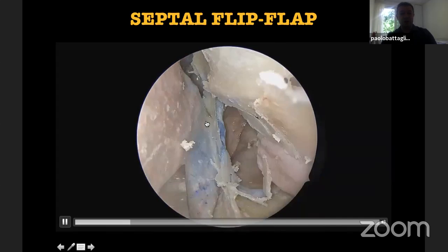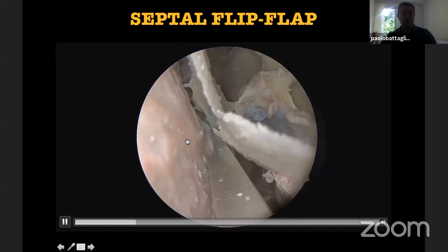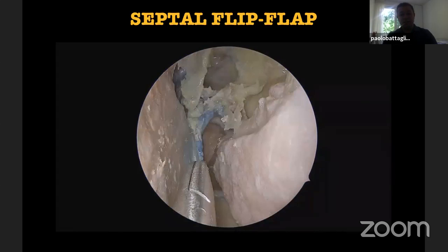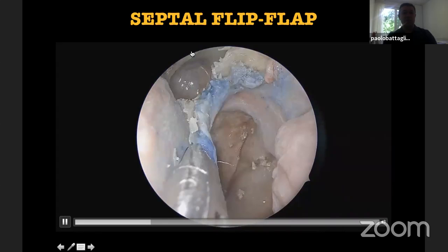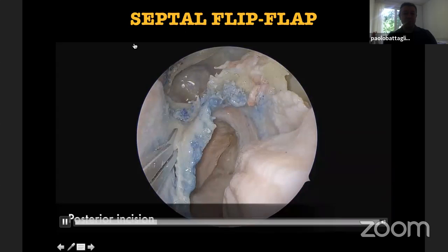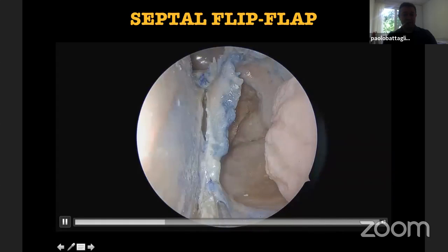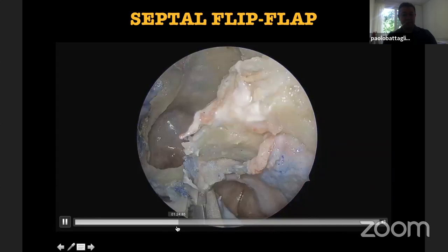We try to maintain the mucoperiosteum, the mucoperichondrium, of the contralateral side. So the removal of the septum continues posteriorly to the rostrum. Here you see the left choana, and we remove the ostium, enlarging and removing the anterior wall of the sphenoid bilaterally. So here we are removing again the last part of the mucoperiosteum of the left side, as you can see.